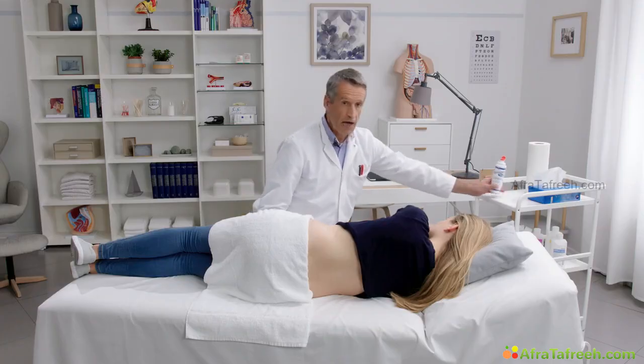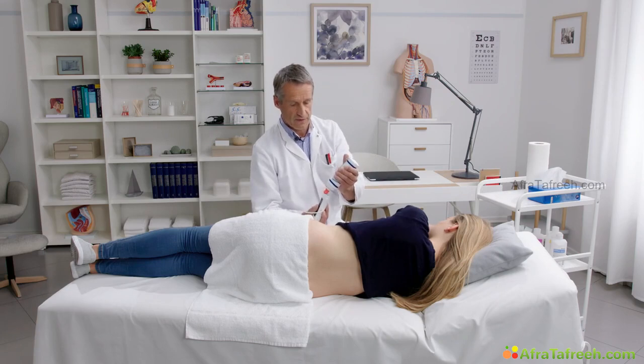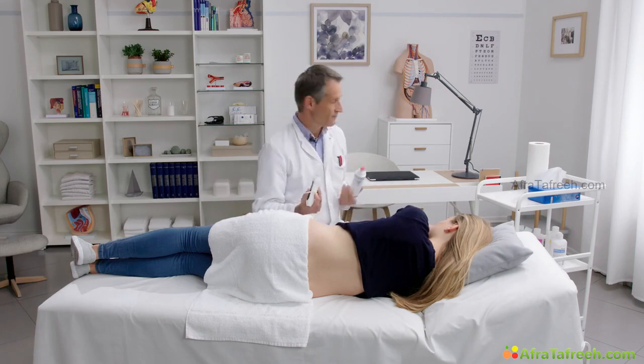Sometimes the kidneys are not visible from the supine position. In this case, you have to ask the patient to turn. I will show you the image acquisition of the left kidney.